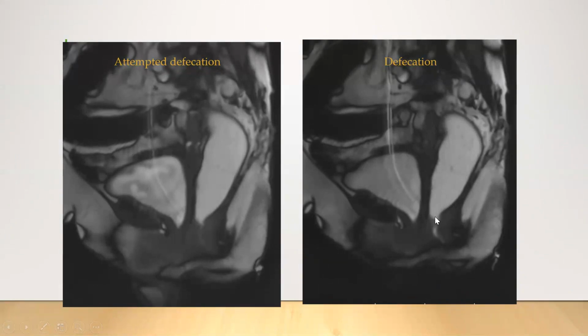But only to emphasize to you again, that it is not enough for us to identify the stricture, but also to identify what could be the possible etiology, and at the same time look for any secondary signs like any muscle atrophy, which could be responsible for the patient not generating adequate anal pressures.